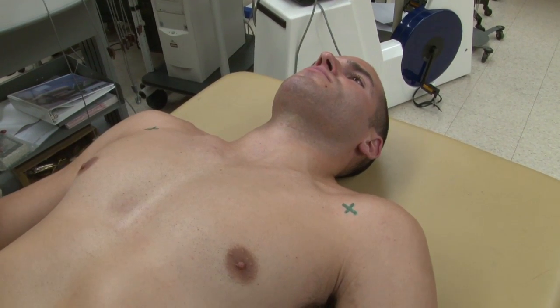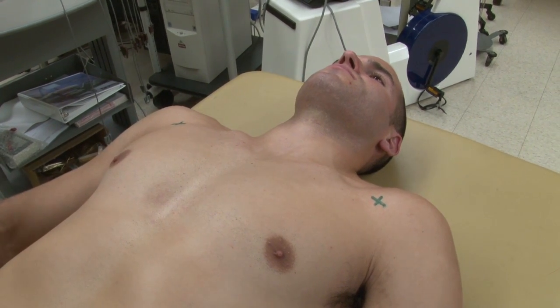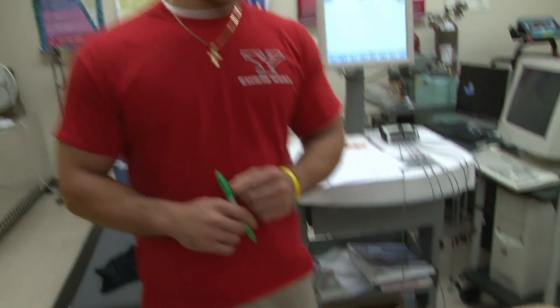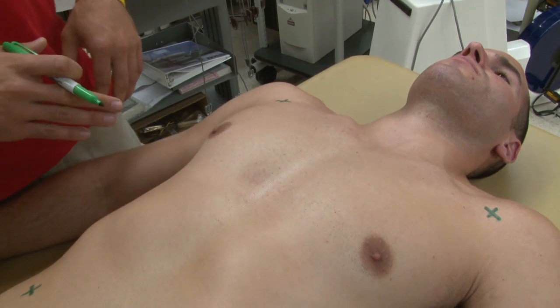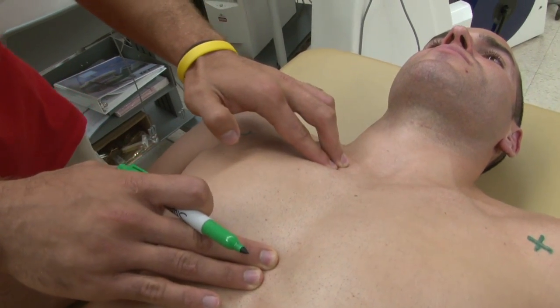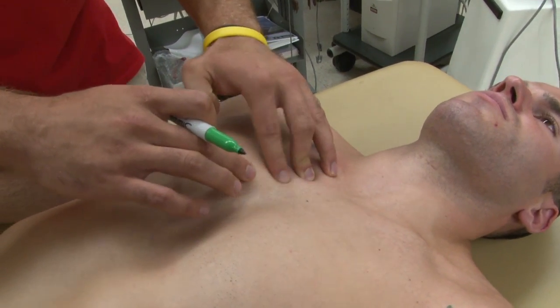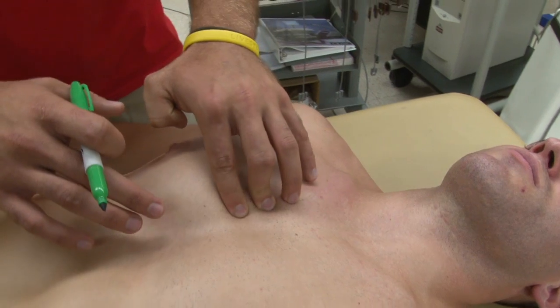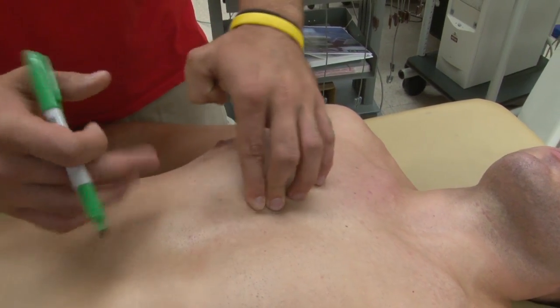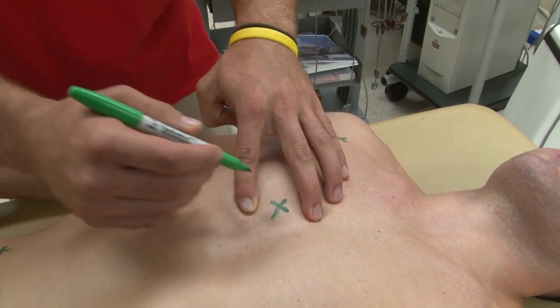Now I'm going to mark the six chest leads. These are the same whether during exercise or during rest — they are always the same. These six leads are named V1 through V6. V1 is on the patient's right side of their sternum. You're going to find the sternum and the clavicle, and then go to the fourth intercostal space and palpate that. The key is you don't want to just eye it up — where you place these is essential to the recordings being correct. You need to make sure you place them in the right anatomical position.